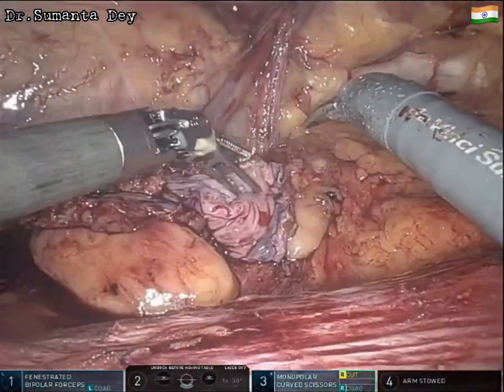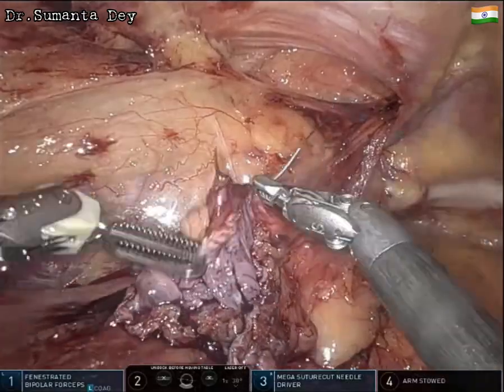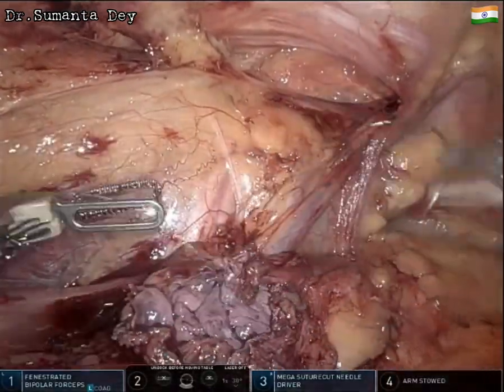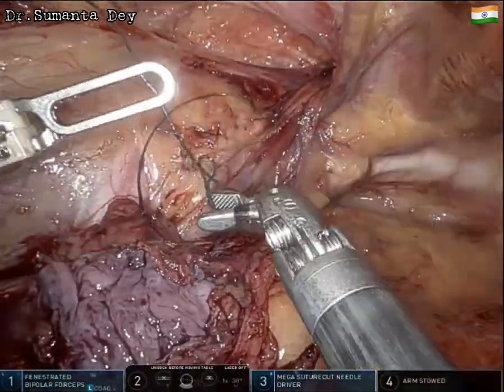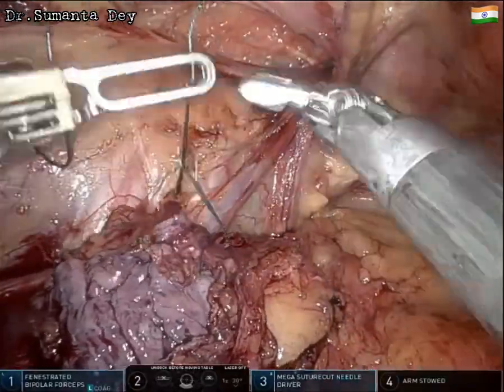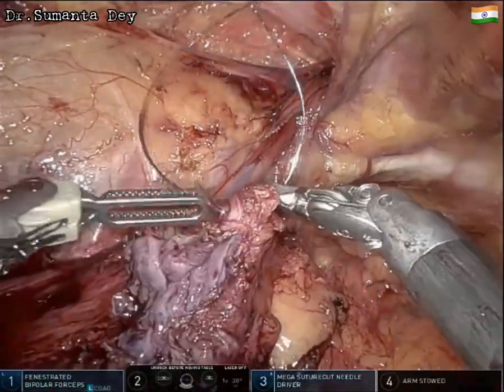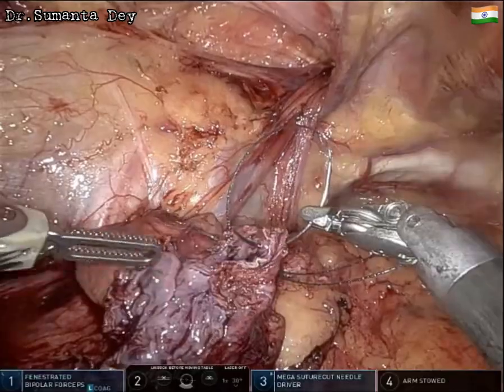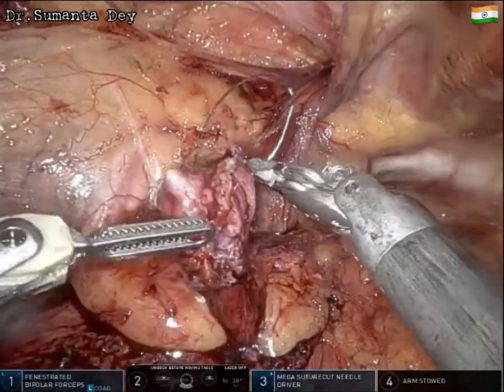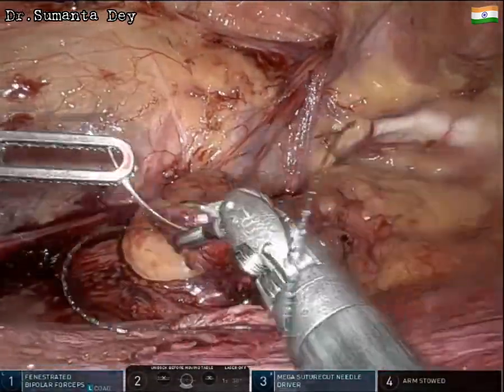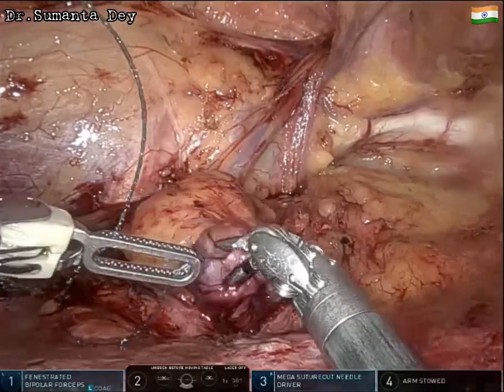Once dissection is complete and hemostasis is confirmed, the divided sac is closed. A 3-0 V-Loc suture that was placed inside the abdomen before docking is used. The sac margin — the peritoneal margin — is closed nicely. The next step is placement of the mesh.